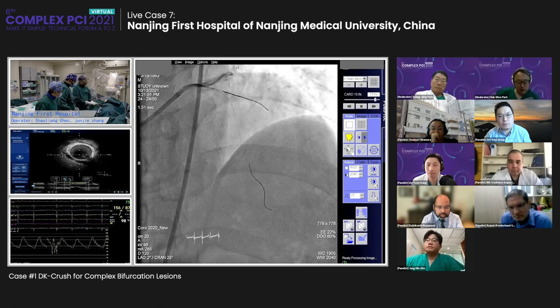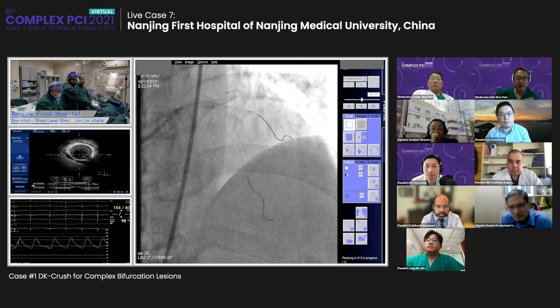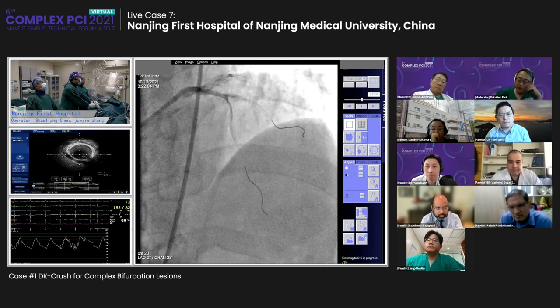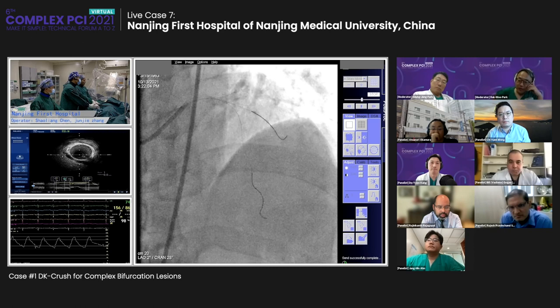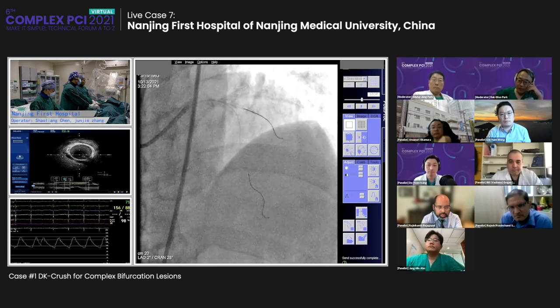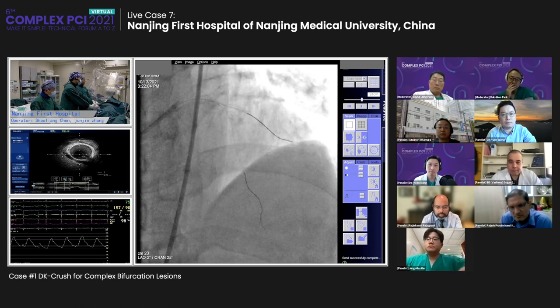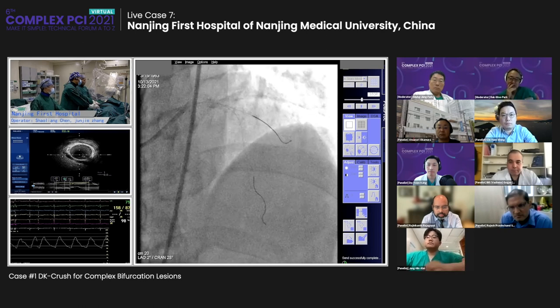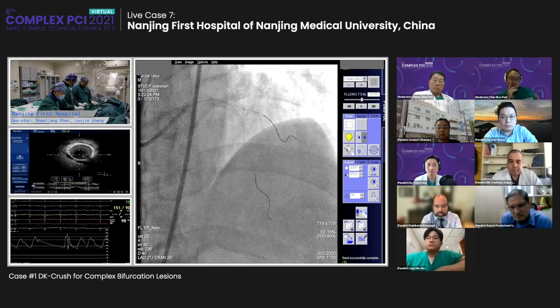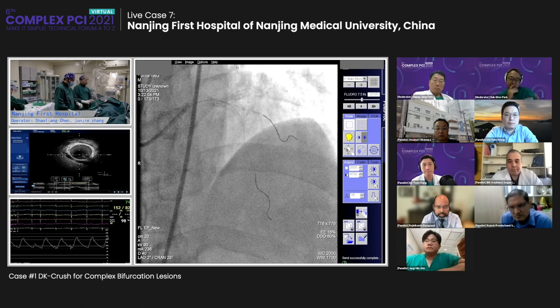You try to reinsert in the proximal part of the crushed stent. Right. Proximal, but not too proximal. If the wire is buried between the two layers of stent, it will be very difficult to advance the balloon. Okay. I think the diagonal wire is a thin blue wire, right? Yes. Okay, give me a 3.0 non-compliant balloon. So I think the first rewire is very successful.